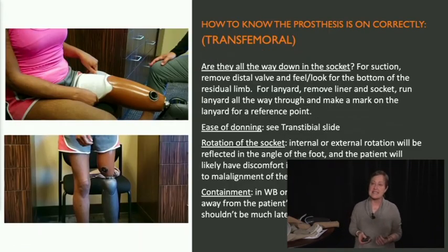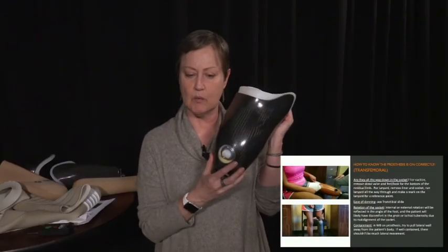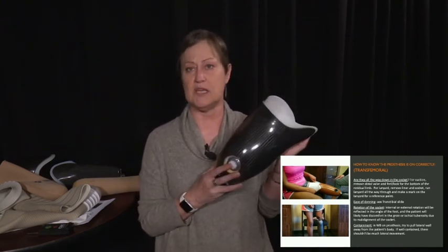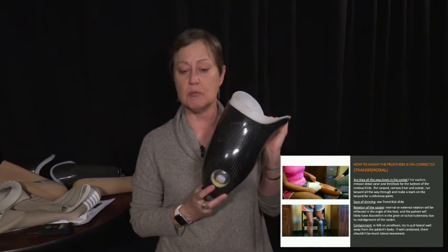For the transfem patient, are they all the way down in the socket? I mentioned already that you can take out this valve to see. So we went through that. Ease of donning, the same story. If it slips right on, that might be too big for them. If you can put your hand down in there, or a sandwich, there's too much room.